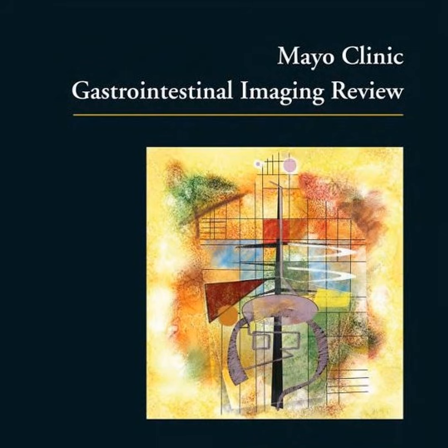Exactly, fatty infiltration of the liver. It's an incredibly common metabolic response. But the lipid accumulation is rarely perfectly uniform. Right, it's patchy. Yeah, you frequently see diffuse fatty infiltration that completely surrounds an isolated island of perfectly normal, spared liver tissue. Which we call focal normal liver.